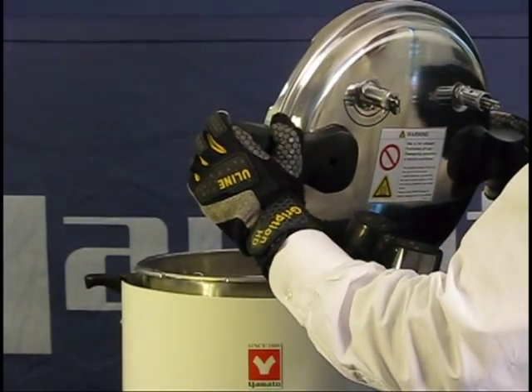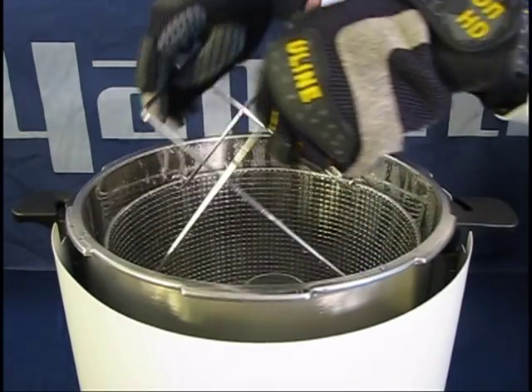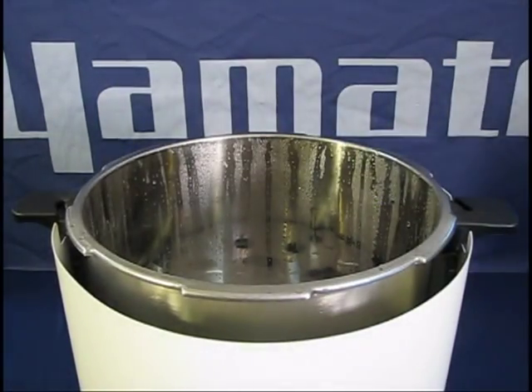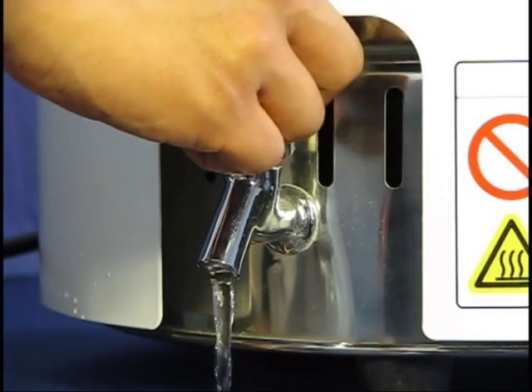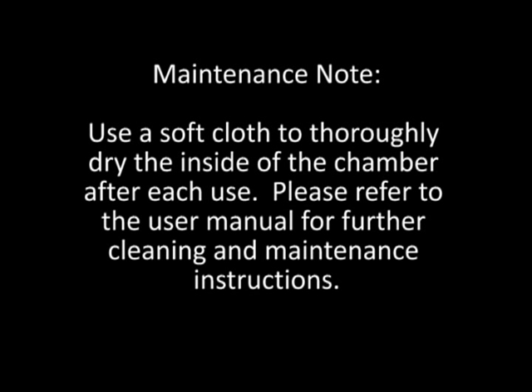This protects your arms and face from escaping steam. Wear protective gloves when removing the basket from the chamber, as the basket and its handles will remain hot after the chamber has cooled down. Have a drain pan ready and drain the excess water from the chamber by opening the drain valve. Use caution as the water may still be hot.